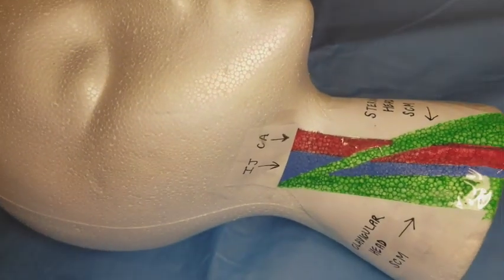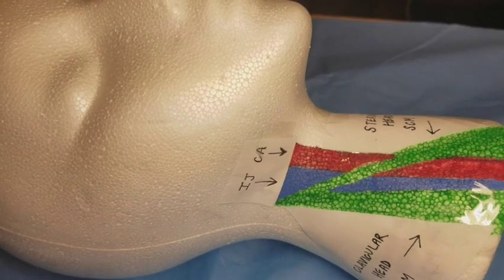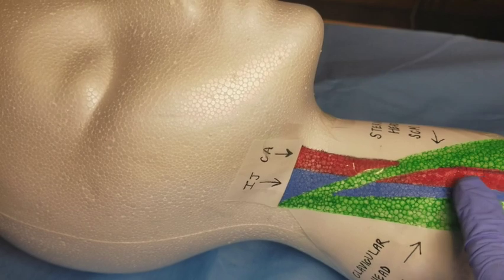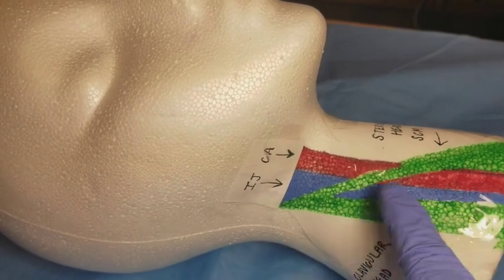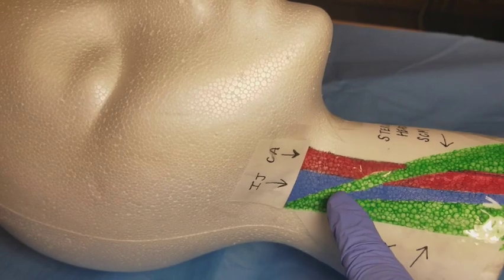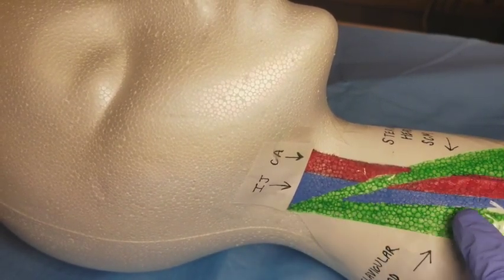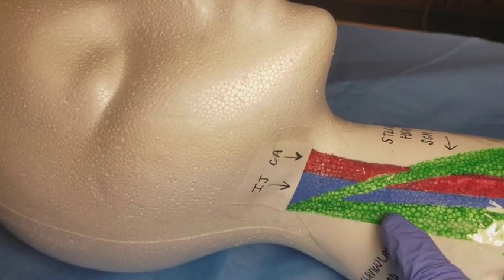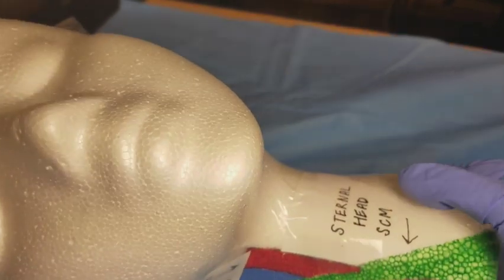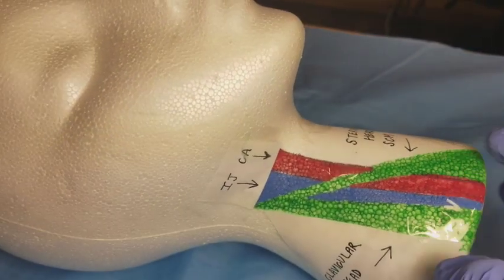Today I want to talk to you about the internal jugular vein insertion point. We're going to be at the patient's right side. This blue represents the internal jugular vein. The insertion point is at the apex of the two heads of the sternocleidomastoid muscle, which is represented in green. This is the clavicular head of the sternocleidomastoid, and this is the sternal head of the sternocleidomastoid muscle.